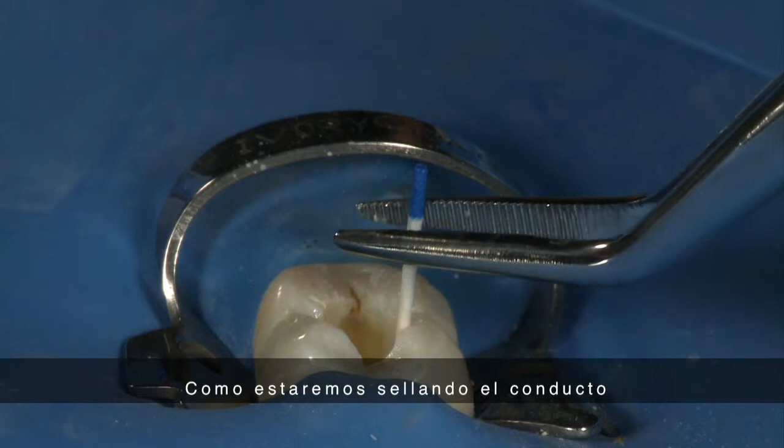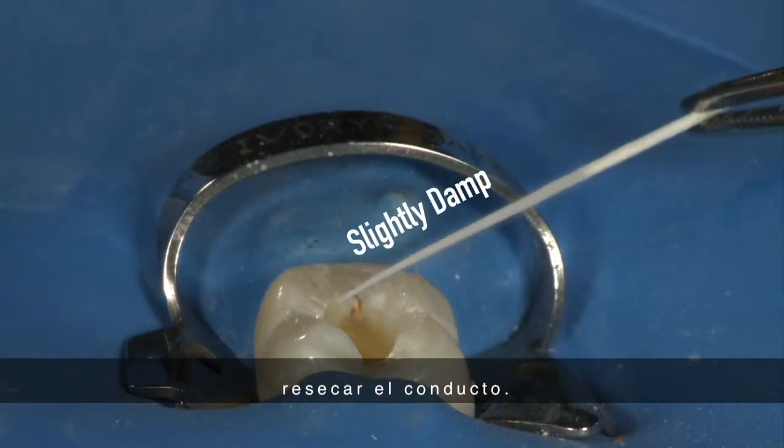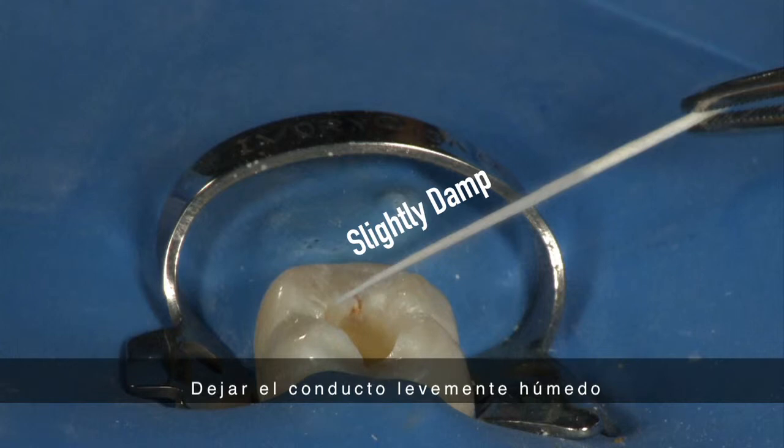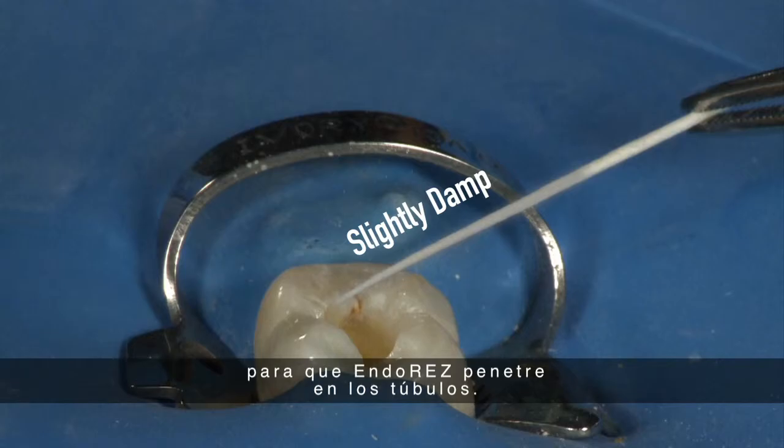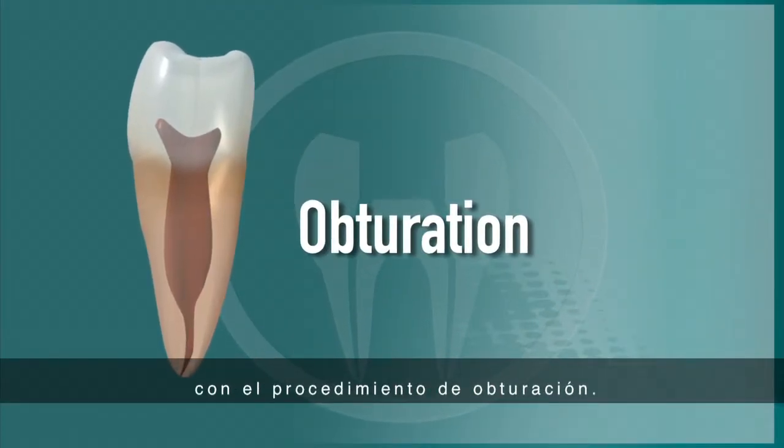Because we will be sealing the canal with EndoREZ, it is not necessary to desiccate the canal. Leaving the canal slightly damp will provide the best environment for EndoREZ to penetrate into the tubules. We are now ready to move on to the obturation portion of the procedure.